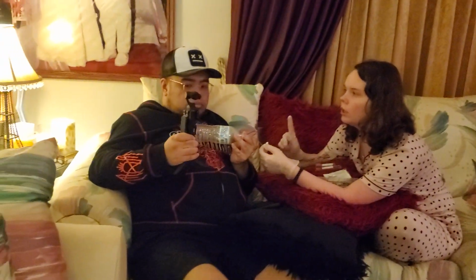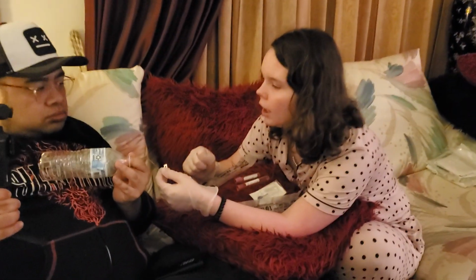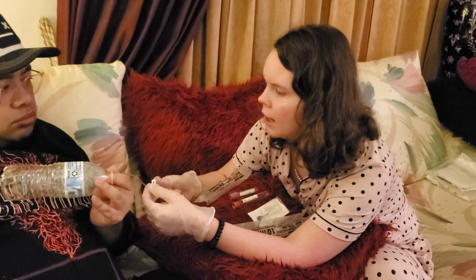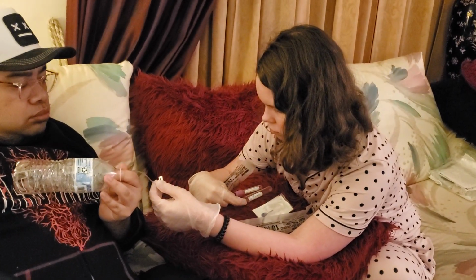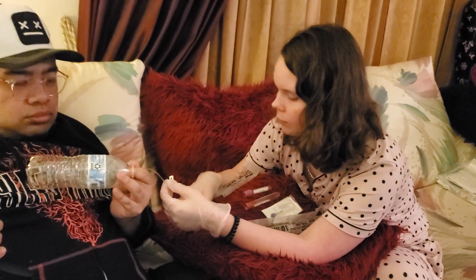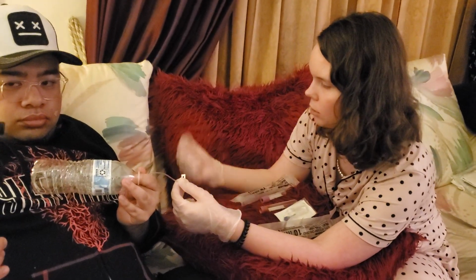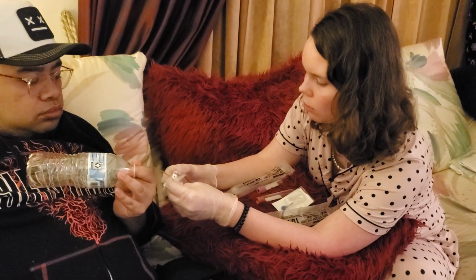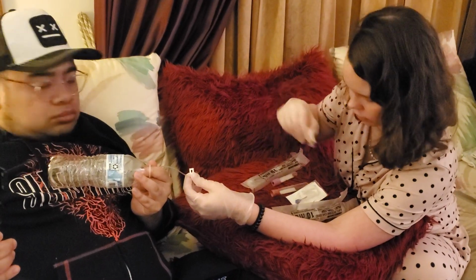Oh, I also need, I can't forget, if I have this skill, I also have to grab a specimen bag, a biohazard bag, and labels for my tubes. I gotta remember that. So yeah, I've also got that. And an extra cap. So I remove the orange cap, throw that away, and I'm gonna wipe this with an alcohol swab for 30 seconds. And then let it air dry.